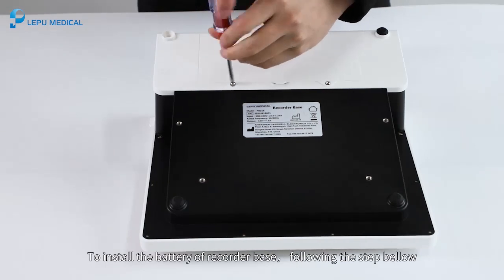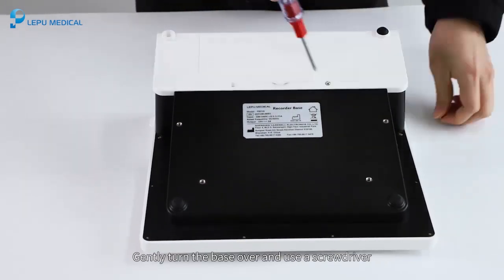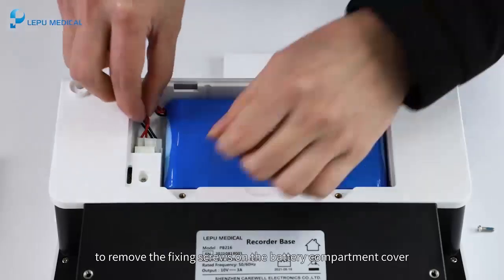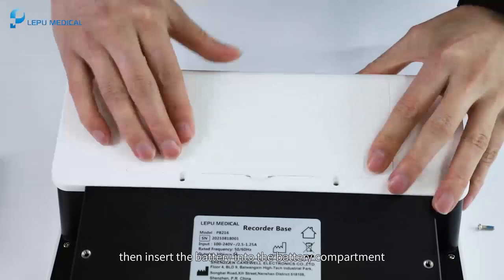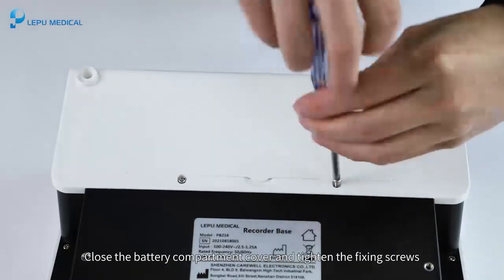To install the battery of the recorder base, follow the steps below. Gently turn the base over and use a screwdriver to remove the fixing screws on the battery compartment cover. Connect the battery plug firmly to the socket on the recorder base, then insert the battery into the battery compartment. Close the battery compartment cover and tighten the fixing screws.